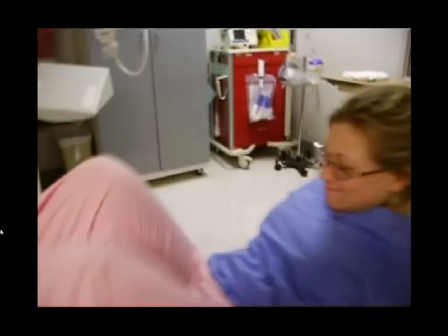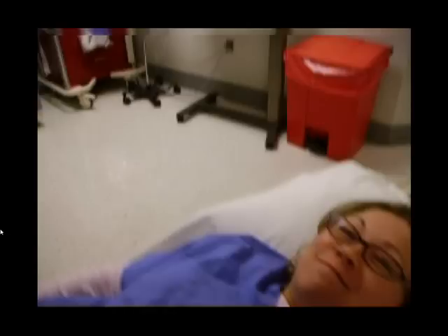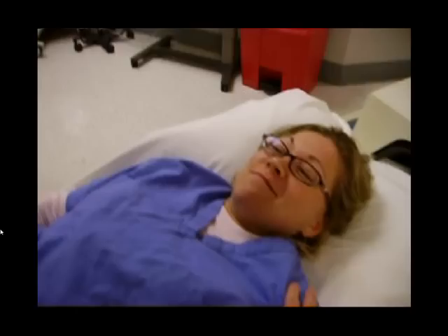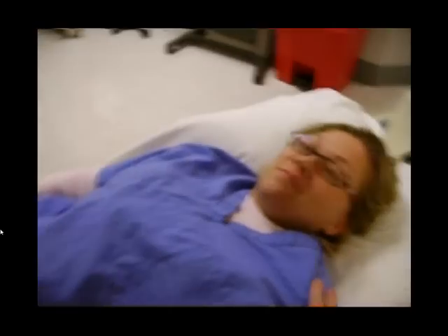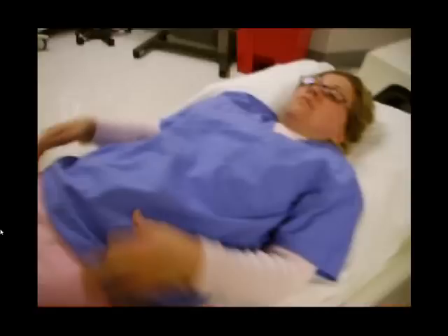Patient position is the same, feet first and supine. Now you want them flat. You can put something up underneath their knees if they're able to. Just get them to relax their knees down. Some elderly people and some people with back problems will be more comfortable if you put a little something up underneath their knees.